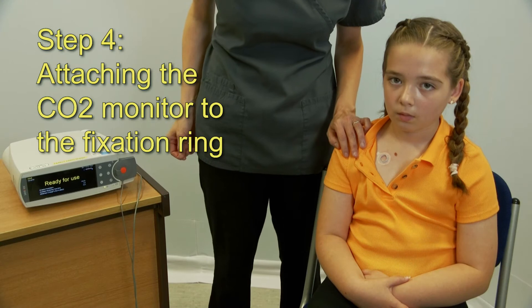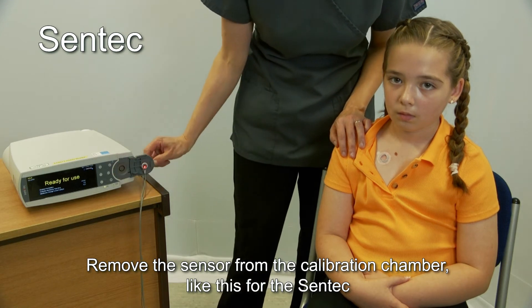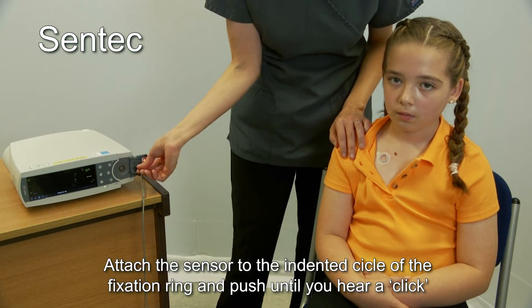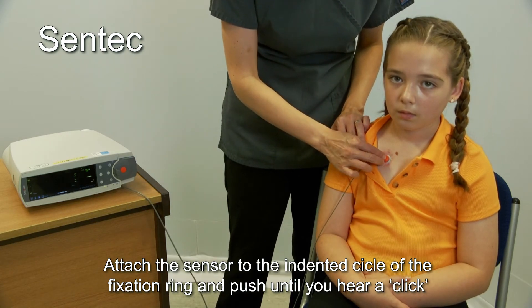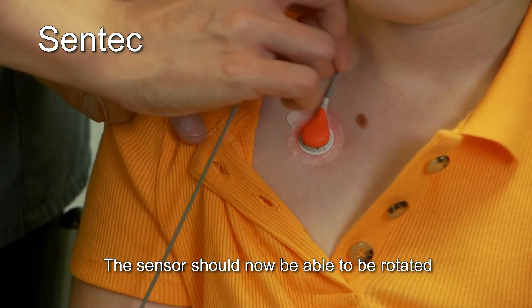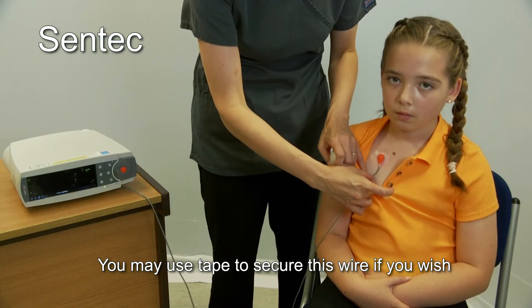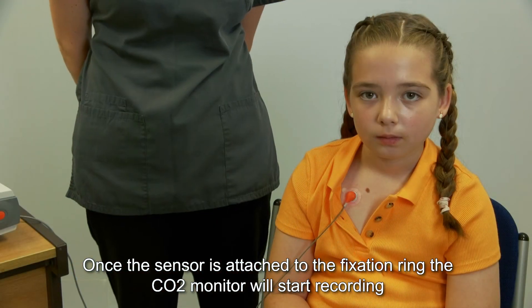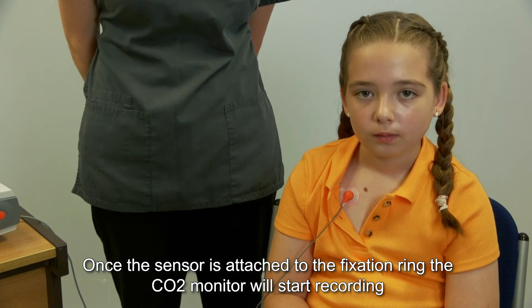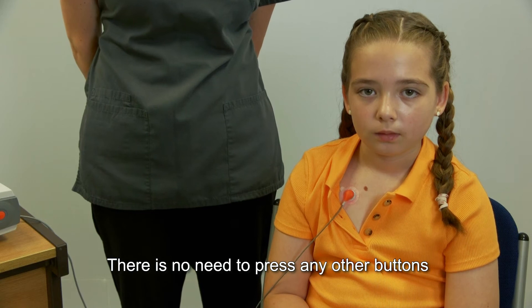Step 4: Attaching the CO2 monitor to the fixation ring. Remove the sensor from the calibration chamber — like this for the Centec. Attach the sensor to the indented circle of the fixation ring and push until you hear a click. The sensor should now be able to be rotated. You may use tape to secure the wire if you wish, but never tape over the sensor. Once the sensor is attached to the fixation ring, the CO2 monitor will start recording — there is no need to press any other buttons.